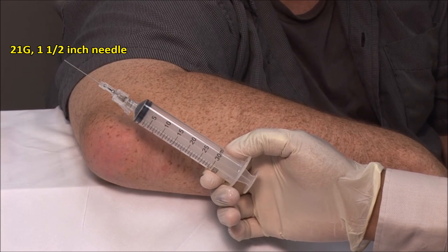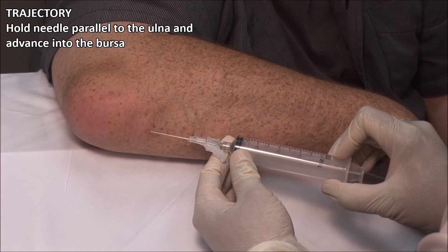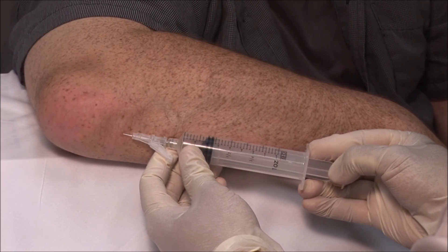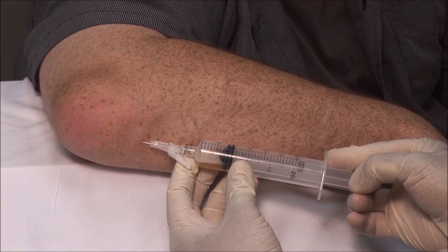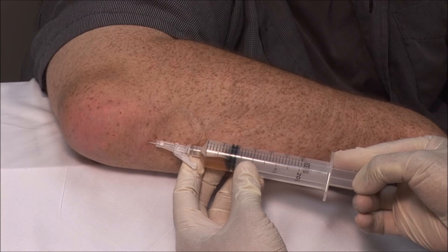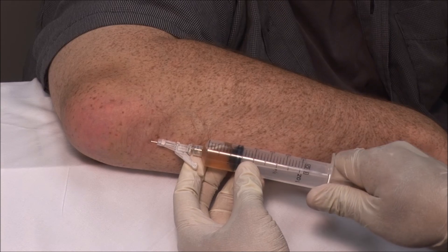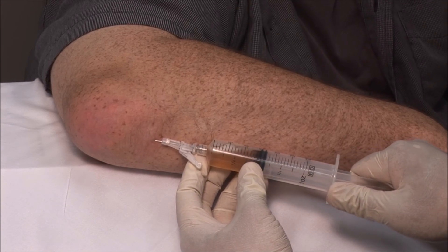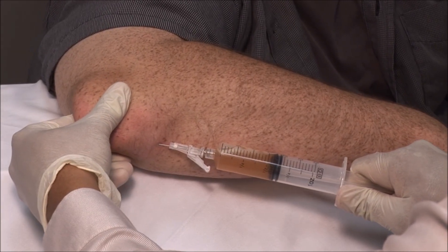I am using a 30 ml syringe with a 21 gauge 1.5 inch needle. Advance the needle into the bursa while aspirating. The fluid is coming out quite freely. Occasionally, if the effusion is loculated, you may need to make several passes with the needle. It is a good idea to apply and release the pressure. You can also stabilize the bursa and apply some pressure to help the fluid to escape.